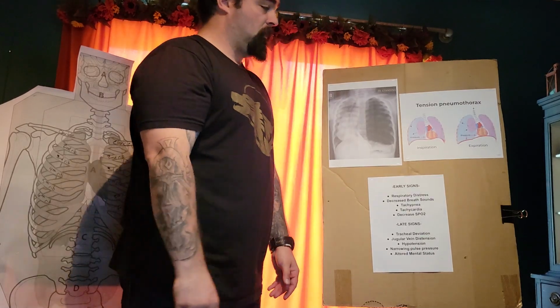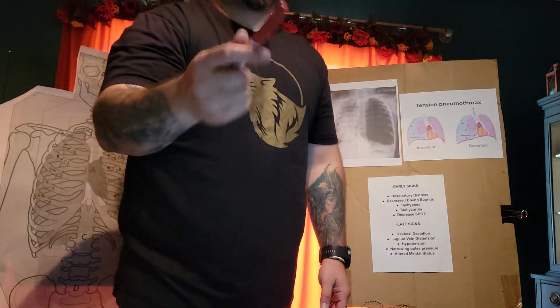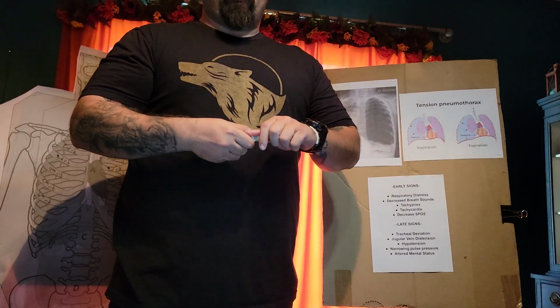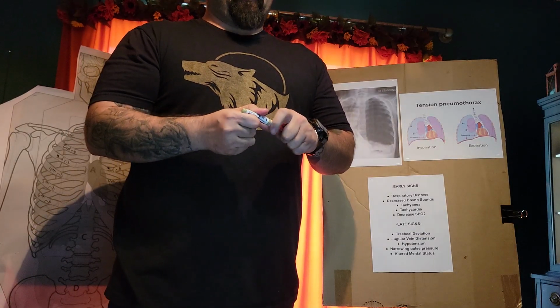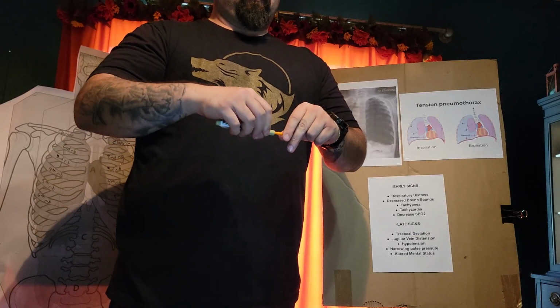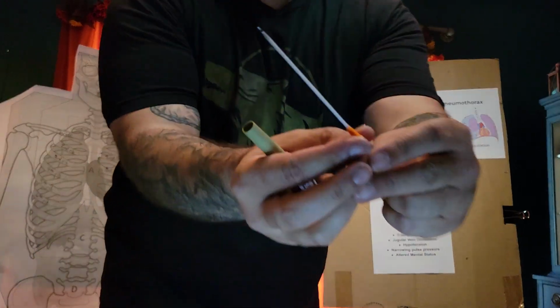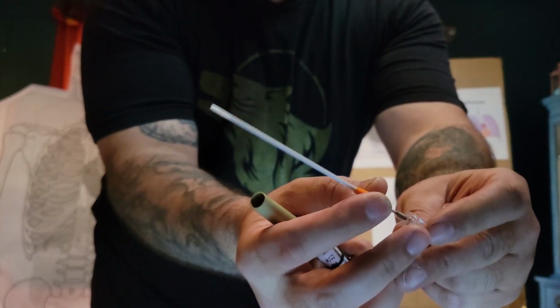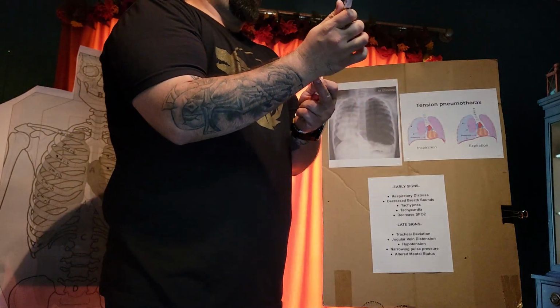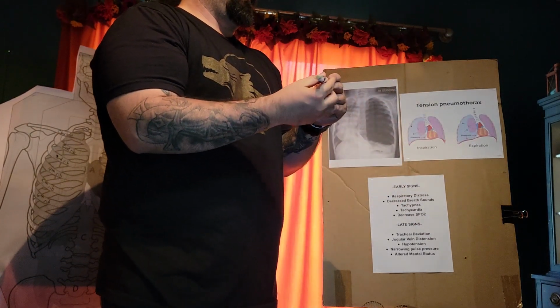So first, what is an NCD? Needle chest decompression is performed with an NCD needle, 14 gauge or 10 gauge. In this case, it's a 14 gauge, 3¼ inch long catheter needle. It is used to puncture the affected side, relieving pressure from a tension pneumothorax.